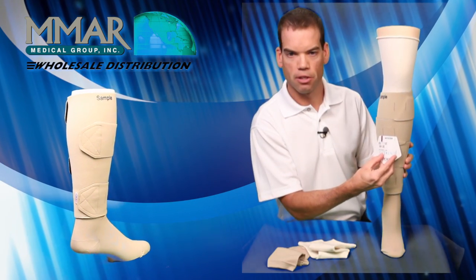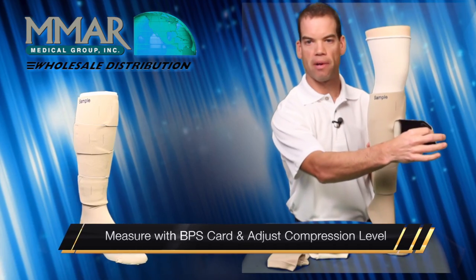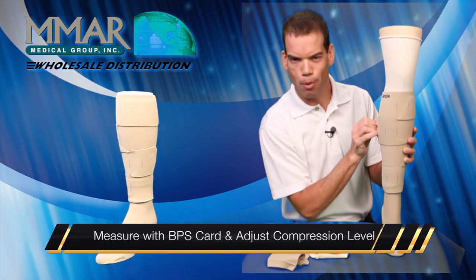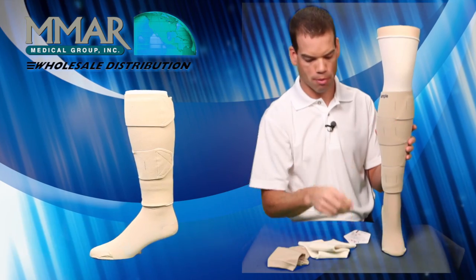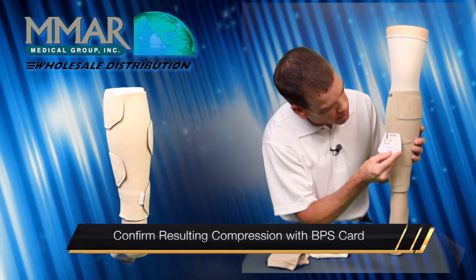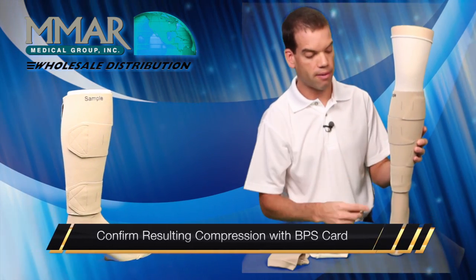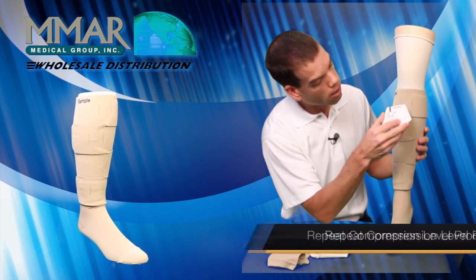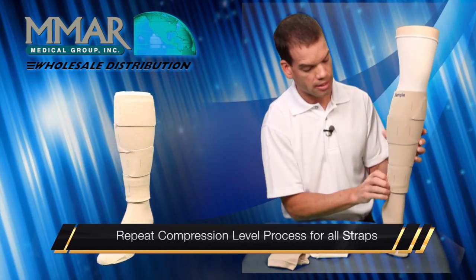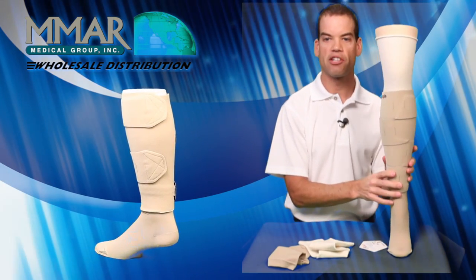What you will do is measure: you open up the Juxtalite, pull it a little more firm or less depending on what level of compression you're looking for, then place your card back up. This one is 20 to 30 right now, so we verified it, and you would continue to do this all the way up with each section until you get it to the required level of compression.